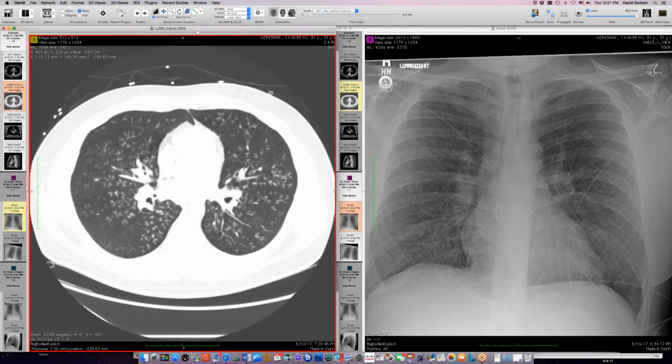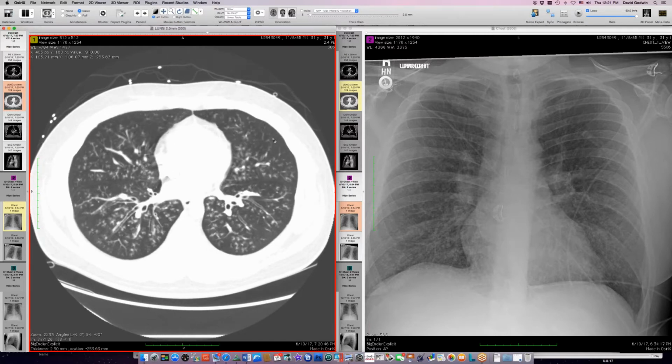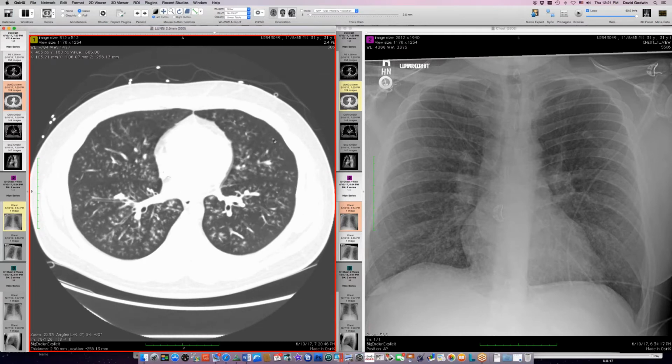Now he has this provocative history: a few weeks before, he was helping a relative clear out a foundation for some construction. I think he was working in a crawl space, and he was exposed to a lot of dust and a lot of mice and mice feces. So everybody was concerned about hantavirus, which is in Washington State. Hantavirus was a consideration, but this doesn't look anything like the cases of hantavirus that have been reported, which look more like lung edema.